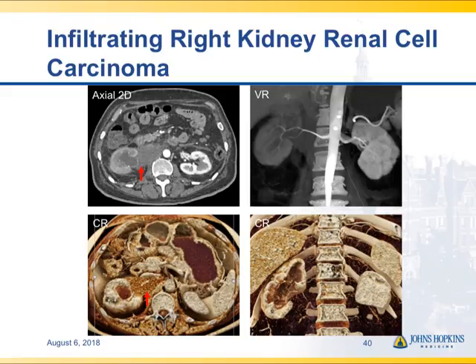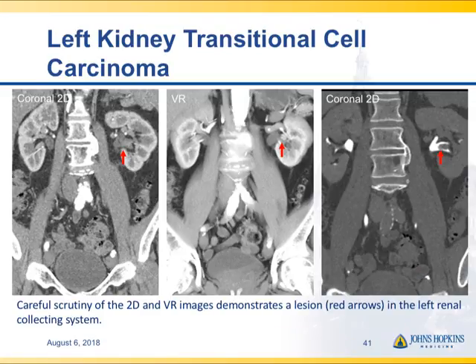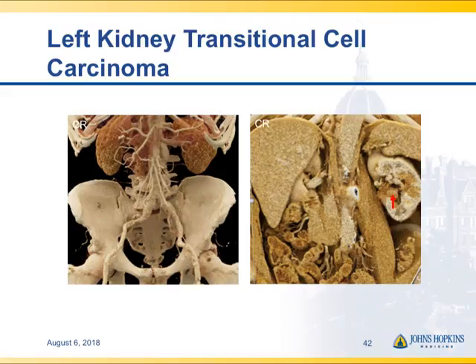In this case, you can see an infiltrating tumor with extensive nodes by the right kidney, with stretching of the renal artery — cinematic rendering very nicely shows the renal artery infiltrated by tumor, where tumor begins and ends, and where the textural changes are. In this example of a transitional cell carcinoma with hematuria, there's a subtle lesion in the left renal pelvis best seen on late phase imaging but also seen in the arterial phase as a soft tissue mass. On 3D imaging, particularly the targeted images, you can see the soft tissue sitting in the renal pelvis near the lower pole collecting systems — very important for classifying and distinguishing between renal tumor types.